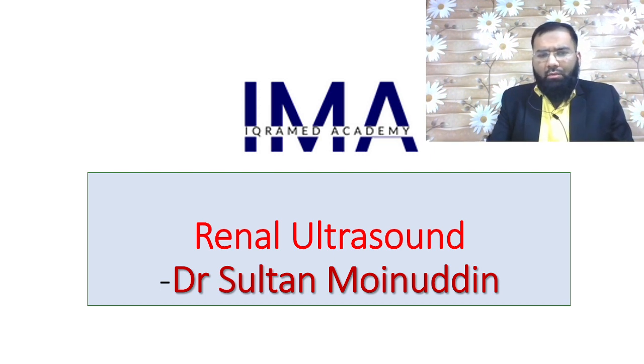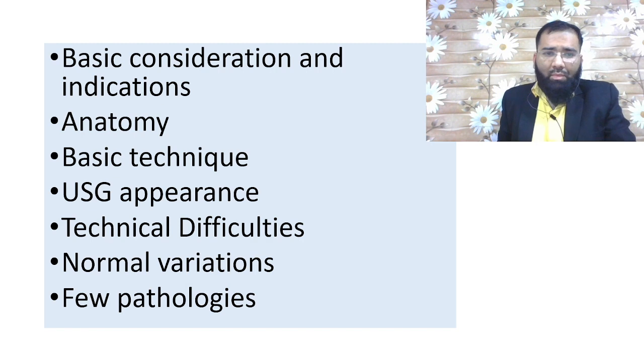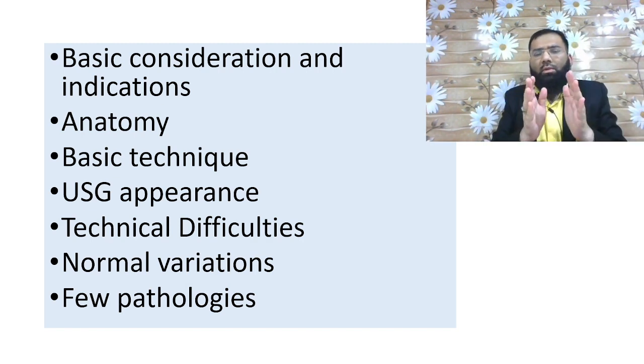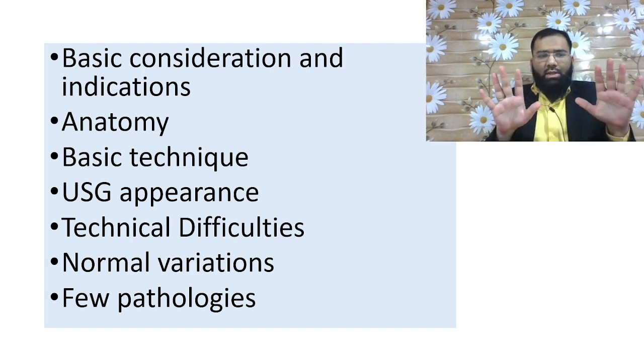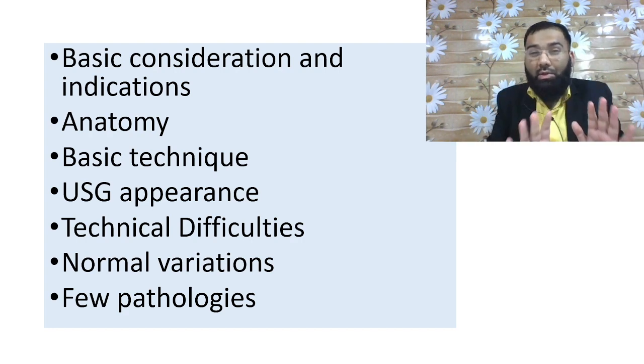So today we have an interesting topic to discuss. We are going to talk on renal ultrasound. So let us start without any delay. Now we'll start with basic considerations. We'll start under what headings we are going to study. So we will study under the seven broad headings. First, we'll see some basic considerations.